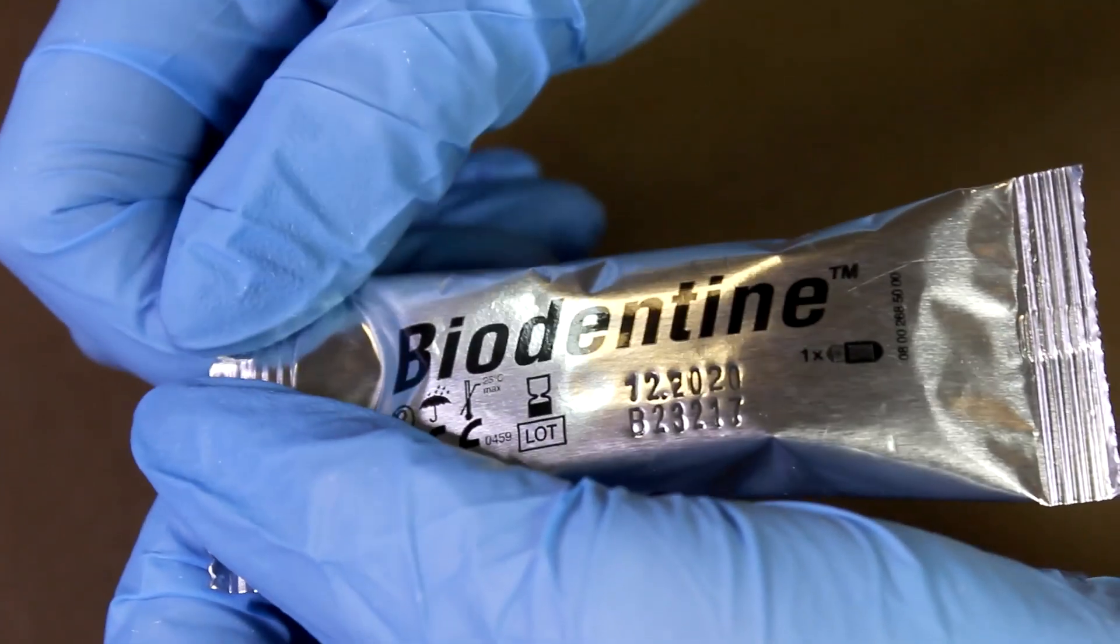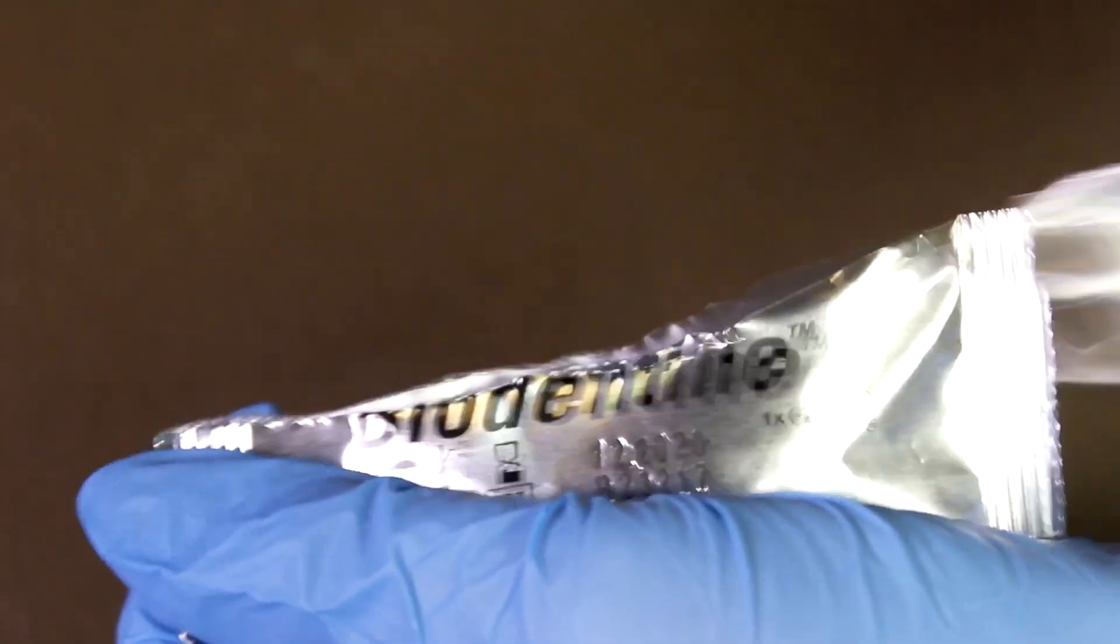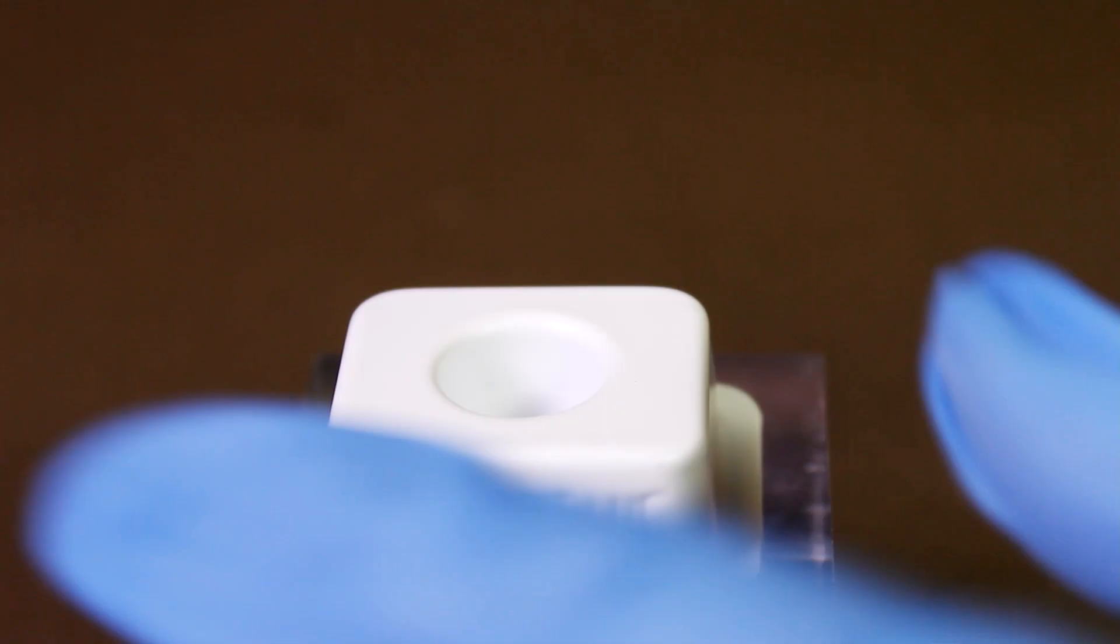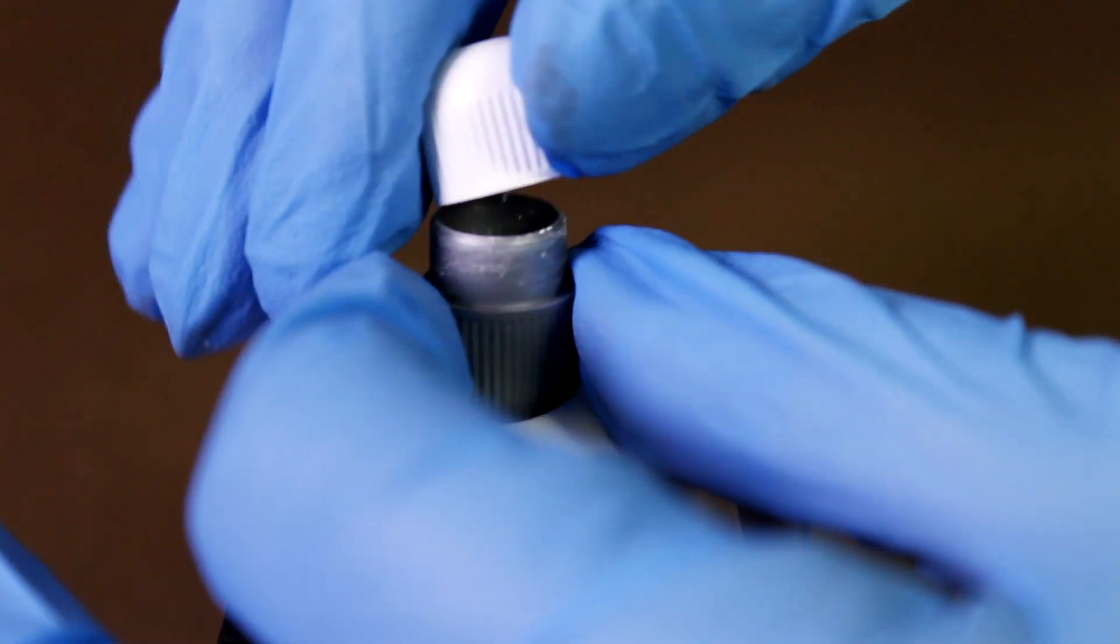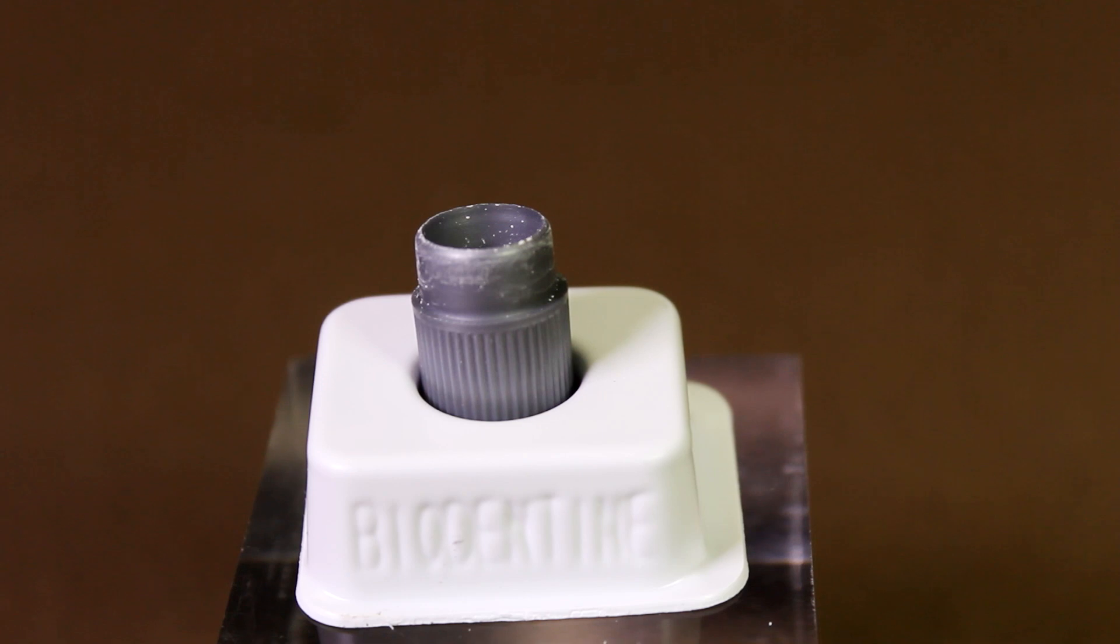Tear open a foil-wrapped Biodentine capsule. Keeping the capsule upright, remove the white cap and place the open capsule into the stand.